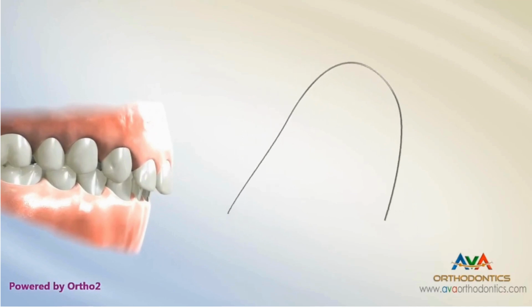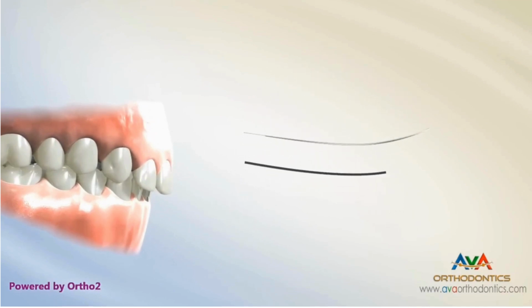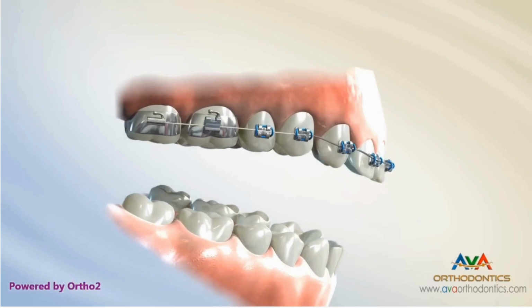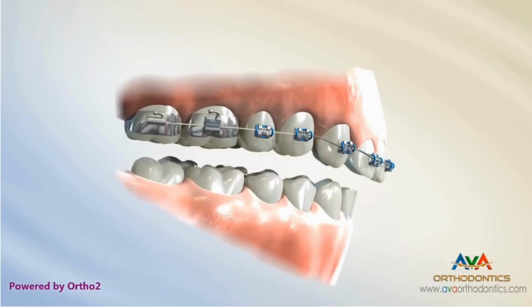In the upper arch, the reverse curve wire has its curvature in an upward direction. In the same way, it intrudes the anterior teeth and relatively extrudes the posterior teeth and treats the deep bite patient.